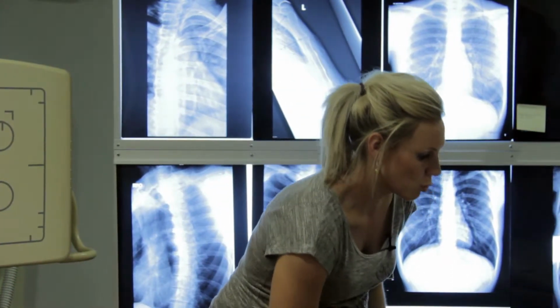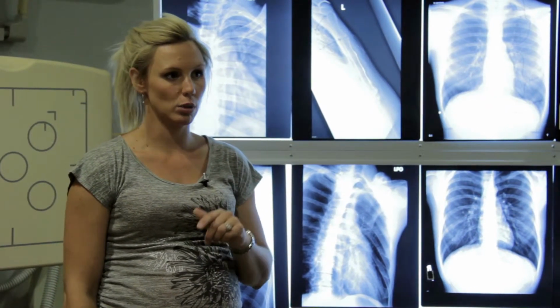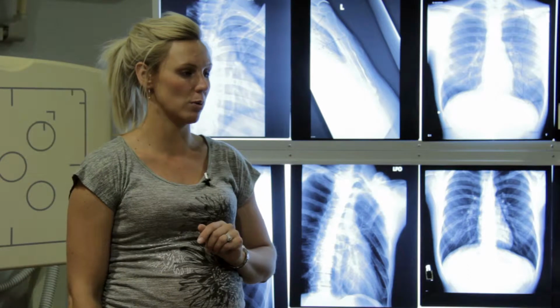Some other scenarios, what if a patient is unable to stand but has upper rib pain? What do you do? What do you start with? What's your first picture?